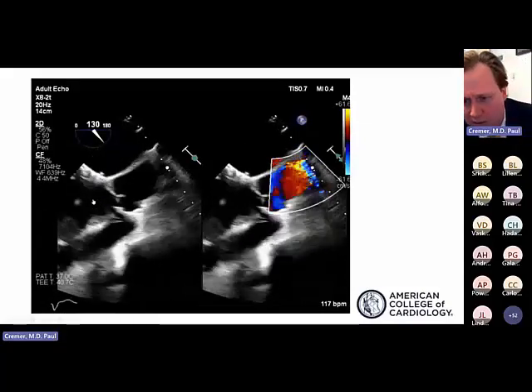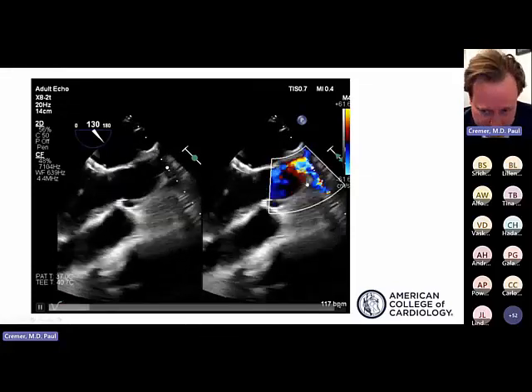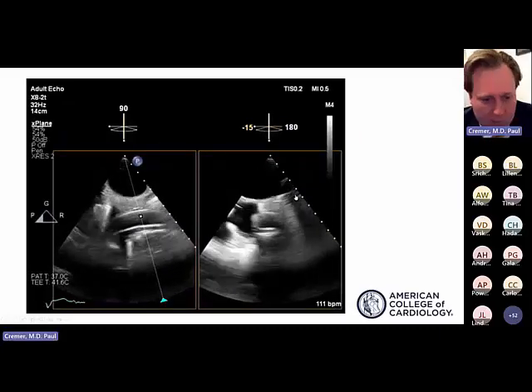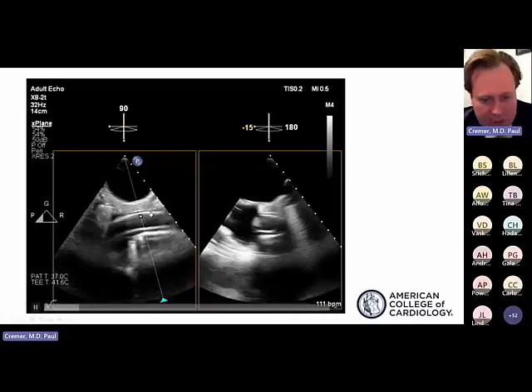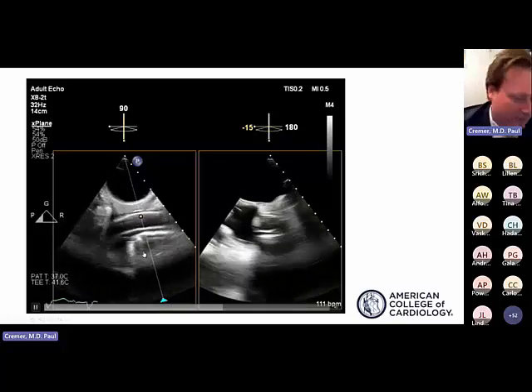The cannula in the ascending aorta is often difficult to visualize. But here, as far as you can see it, there's no evidence of endocarditis involving that cannula either. And looking a little more superiorly, we can see part of the outflow cannula anterior to the ascending aorta, and at least what we see of it looks okay.